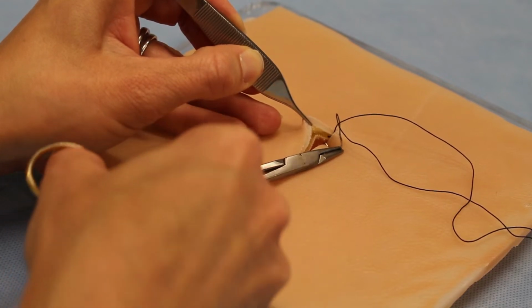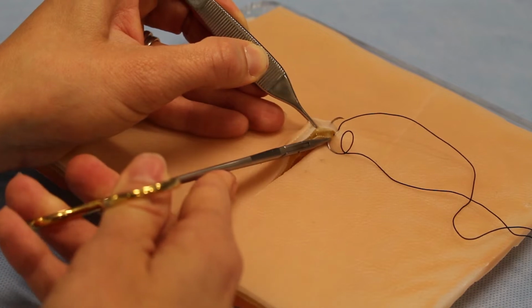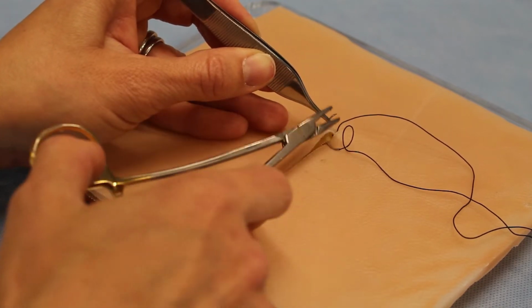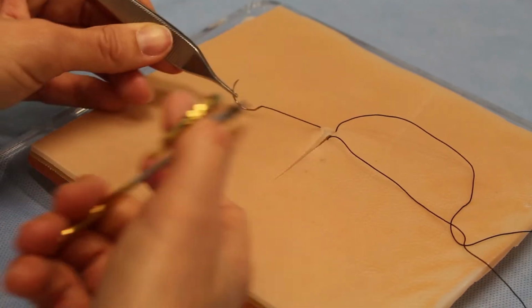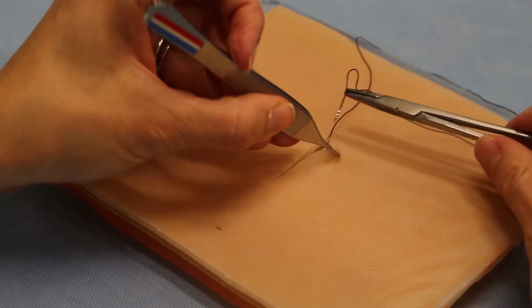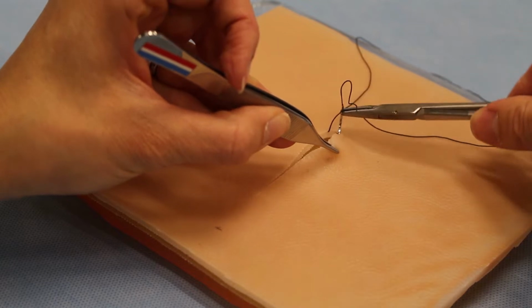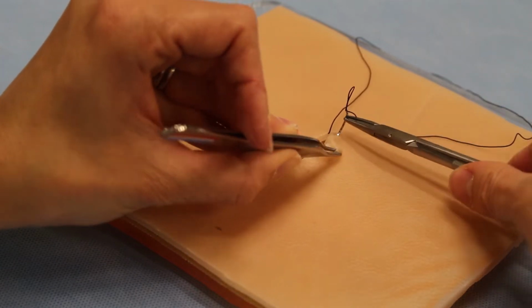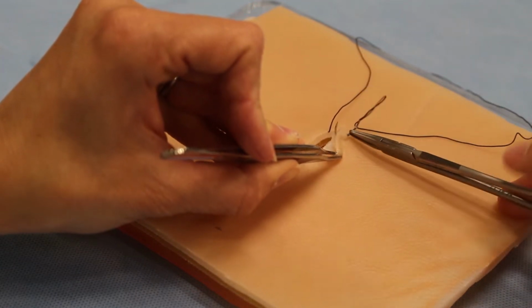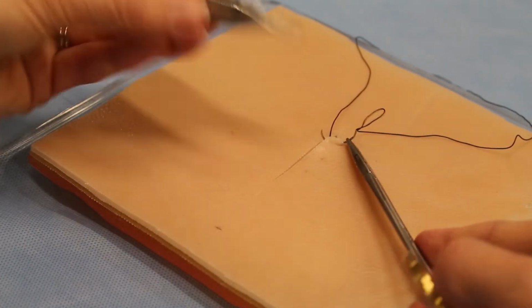So we have to once again start deep and then come back out to our superficial plane, once again right below the epidermis within the dermis. Now our suture will be coming out at the level of the subcuticular plane. So as we run this, you want to go back in at that same level, and you want to try to go in 90 degrees, rotate back, grab some tissue. You see the tip was coming out. The tip's going to come out further down, and so you're in that dermal area.